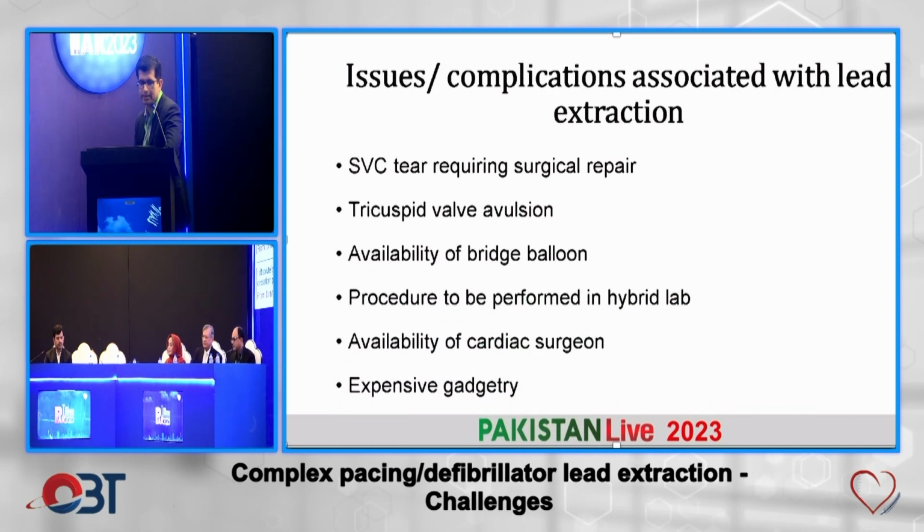That's why, among other things, we require a bridge balloon. It is a non-compliant big balloon which is used to temporarily seal the lesion to buy some time in which the surgeon can open the chest and repair the lesion. And of course, the procedure is preferably performed in a hybrid lab because there is no time to shift the patient to a dedicated OT in this situation. One of the problems in Pakistan, of course, is that this gadgetry is quite expensive.